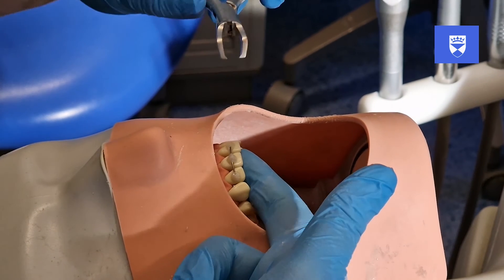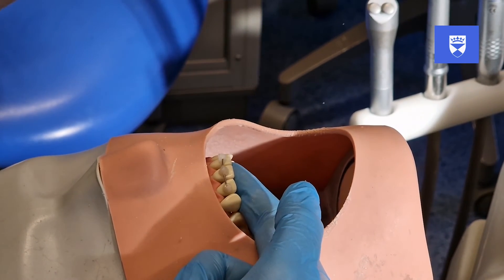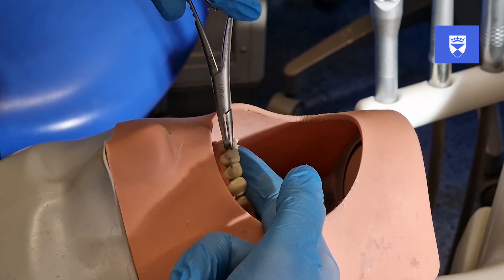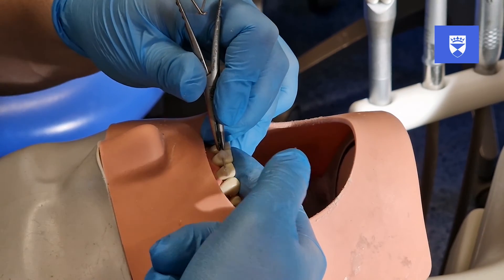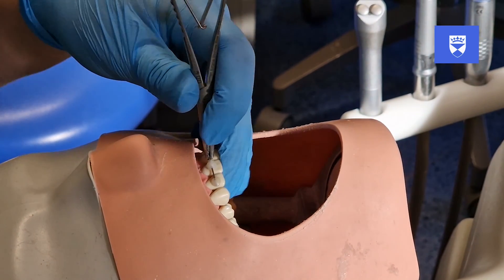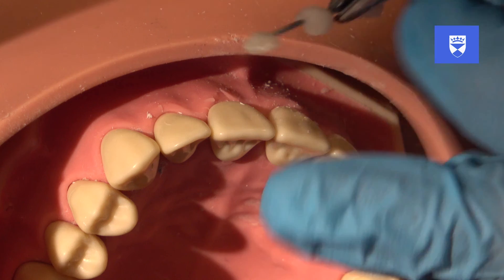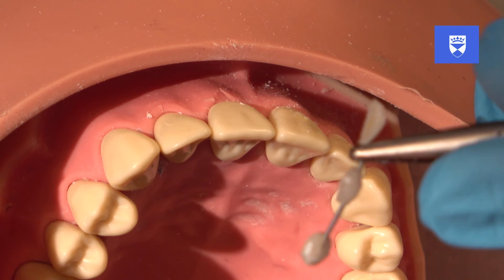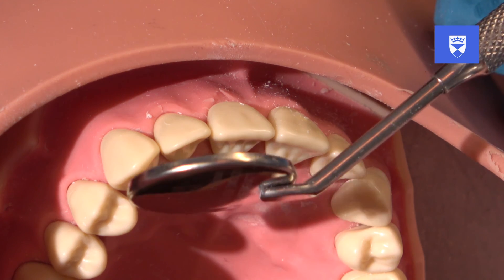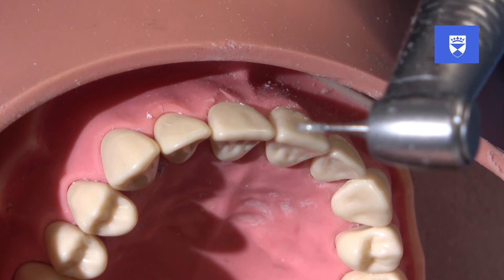Use the bracket removers to then debond one of the abutment teeth. Before debonding the final abutment tooth, ensure that the splint is firmly grasped with a locking instrument. The airway can also be protected with gauze and the patient could be sat in an upright position at this time. Use the bracket removers now to then debond the last abutment tooth and safely discard the splint in the sharps bin. Any residual composite should then be removed with composite finishing or orthodontic debonding burrs, taking care not to damage the underlying tooth surface.